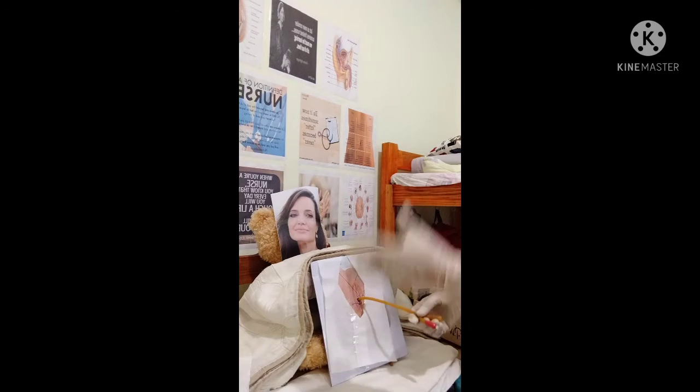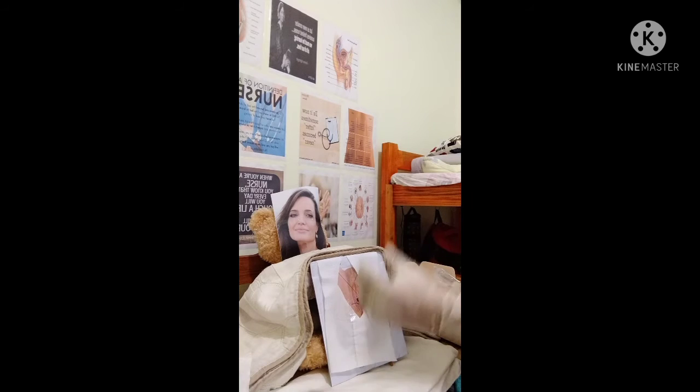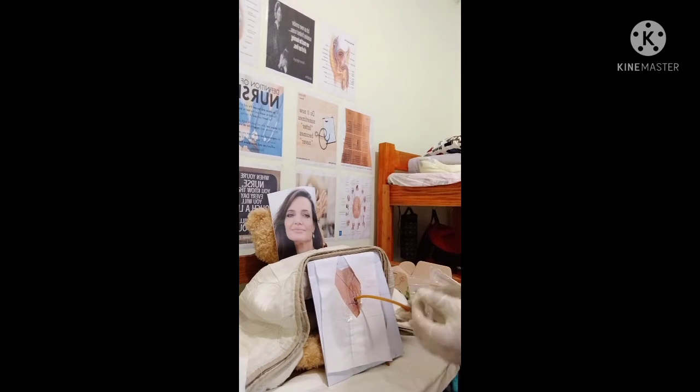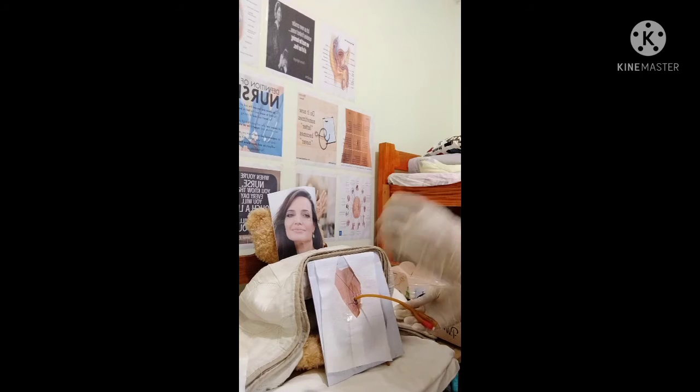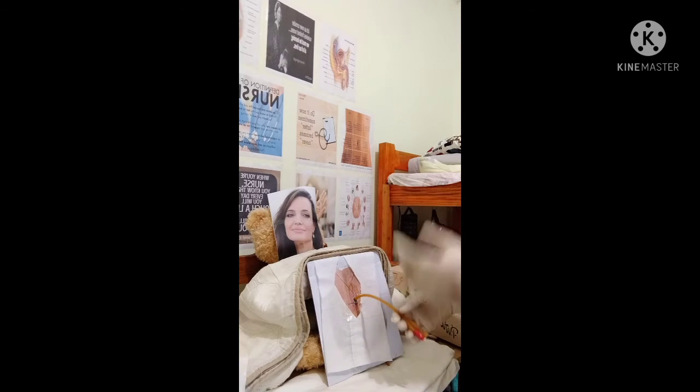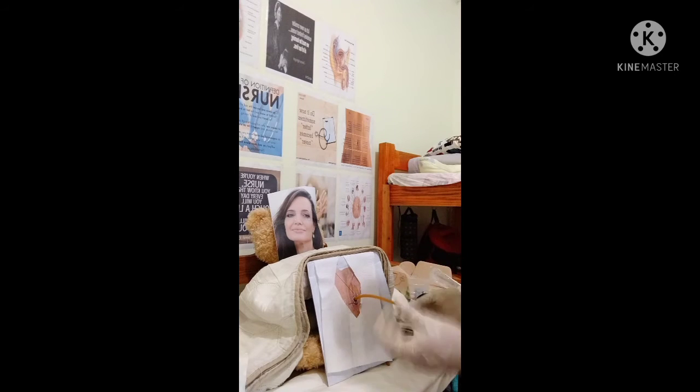So if a specimen is to be collected, pinch the catheter with the thumb and the finger while placing the specimen container in position, so that urine doesn't leak out. And after that we need to rest the hand on the pubis while holding the catheter in place to prevent the pulling and pushing of the catheter, because once the catheter is pulled, it is considered to be contaminated.